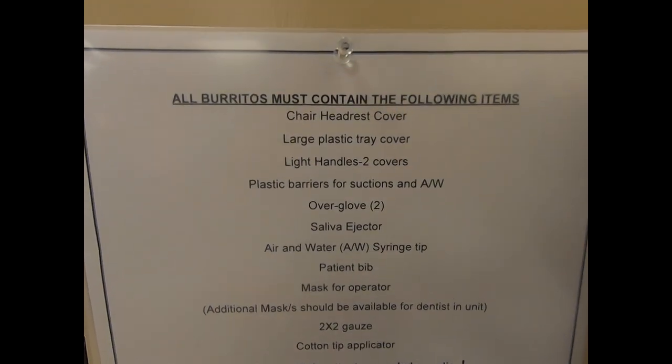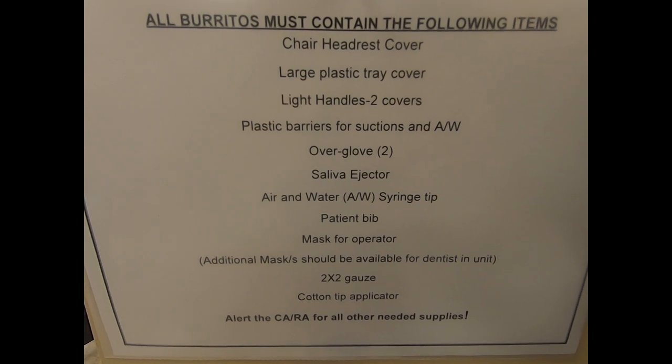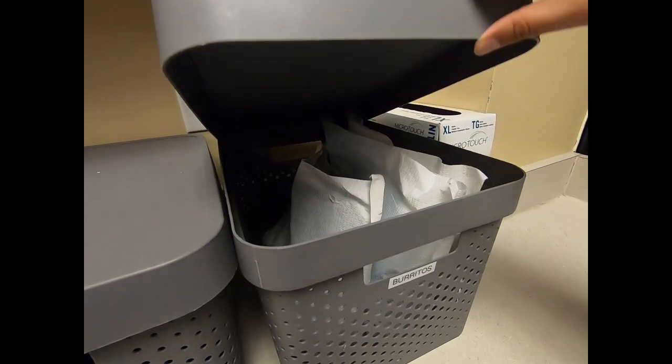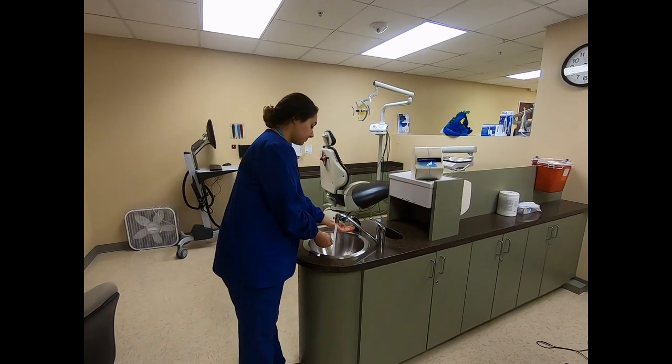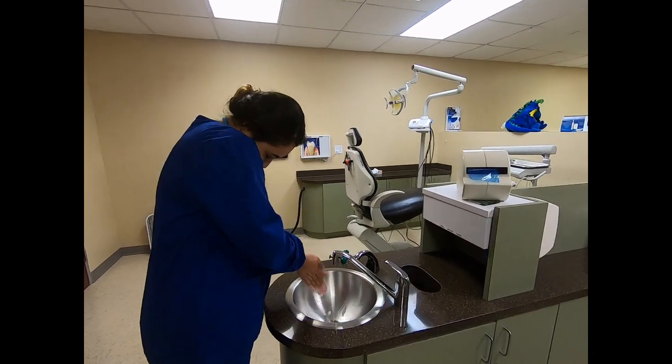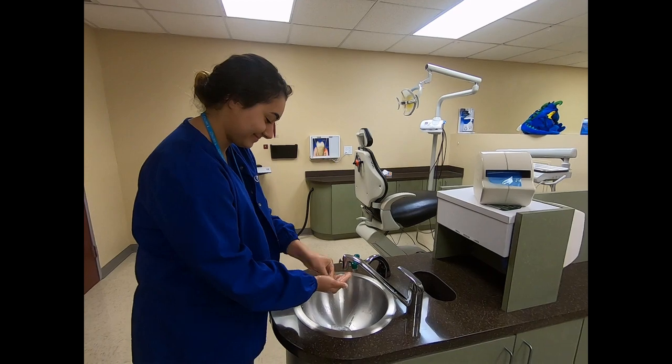For your operatory skill assessment, you will need a burrito. Within the burrito contains all items necessary for PPE, infection control, and patient treatment. When you enter the operatory to begin setup, you should be wearing your lab coat. You will first begin by washing your hands for 40 to 60 seconds per WHO.